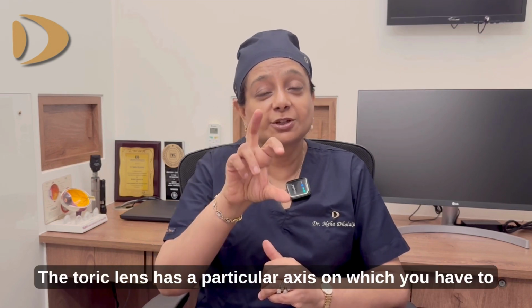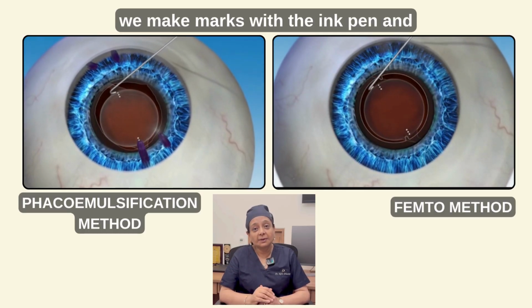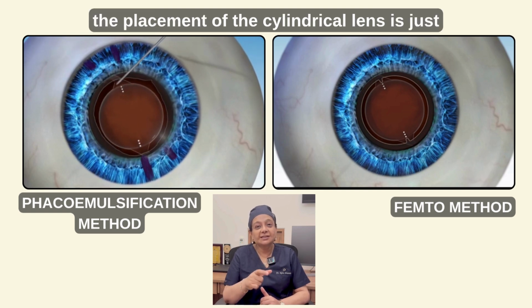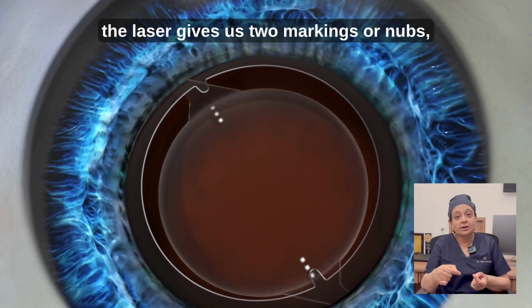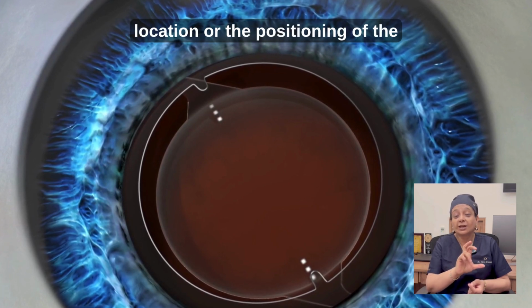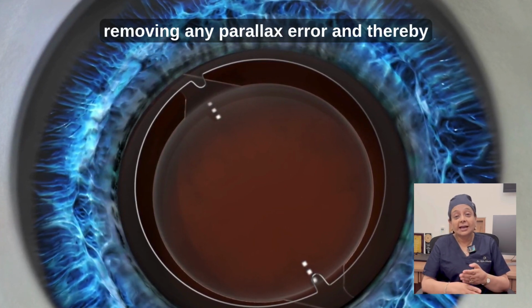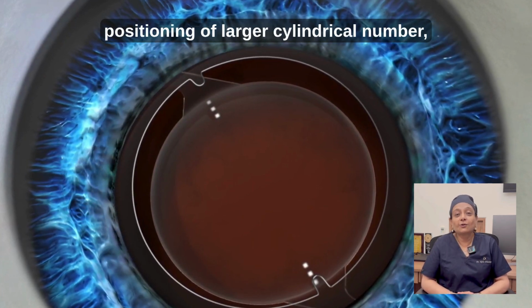The toric lens has a particular axis on which you have to place it. So in the manual technique, we make marks with the ink pen, and therefore the cylindrical axis can be off by 5 degrees here or there. However, in the femto laser, the placement of the cylindrical lens is just perfect. On the capsulorhexis, the laser gives us two markings or nubs, which is called the IntelliAxis, thereby taking into account the exact location or the positioning of the toric lens even after cyclorotation, and therefore removing any parallax error and thereby giving the perfect positioning of the cylindrical or toric lens.